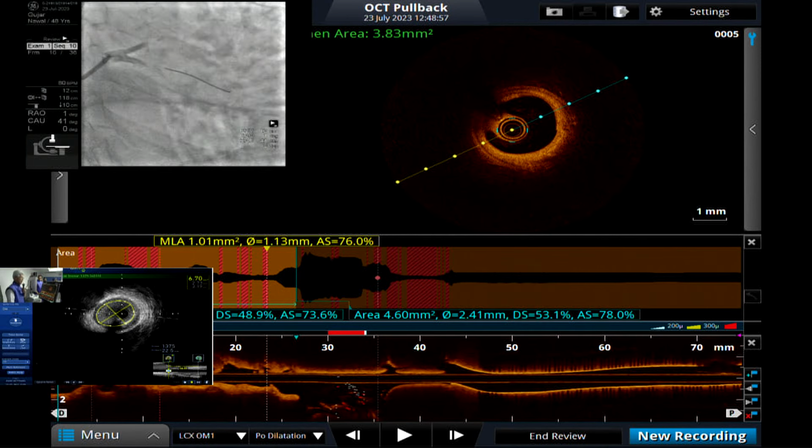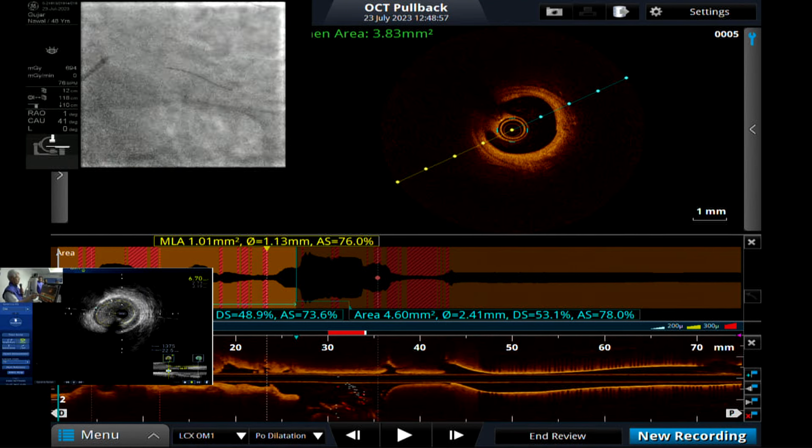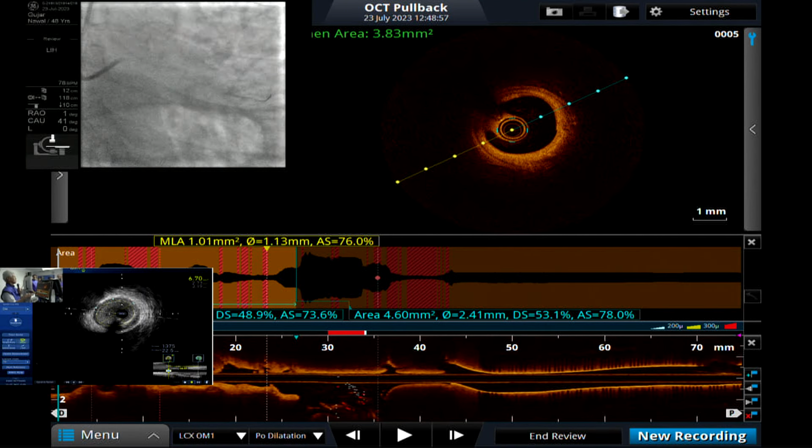So 28 is more than enough. 28. Yes. 28 is more than enough. The length by OCT might be 26. Yeah, so 28. Yeah, that's fine. Perfect. Yep. So now again, just show me the last angio. Yes.